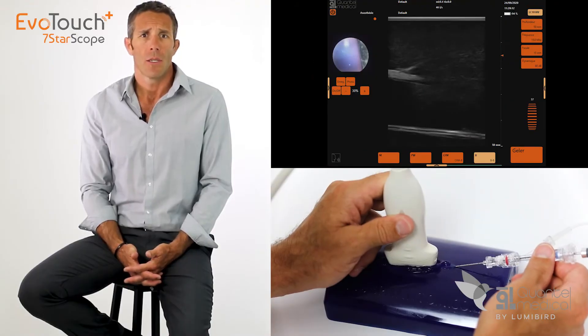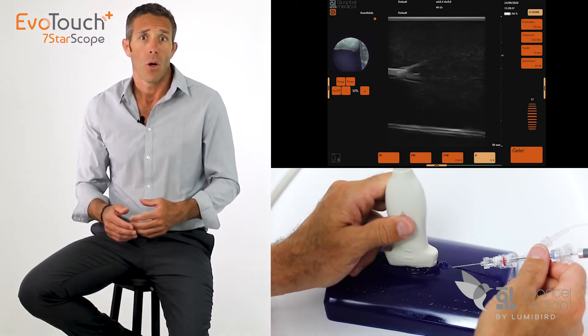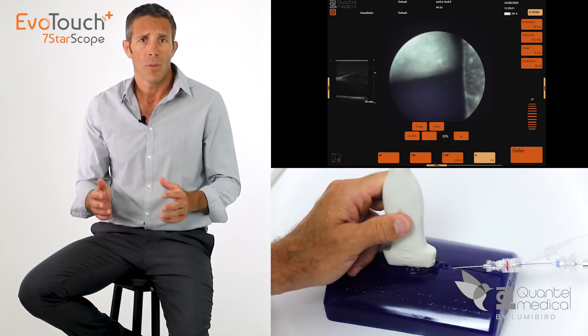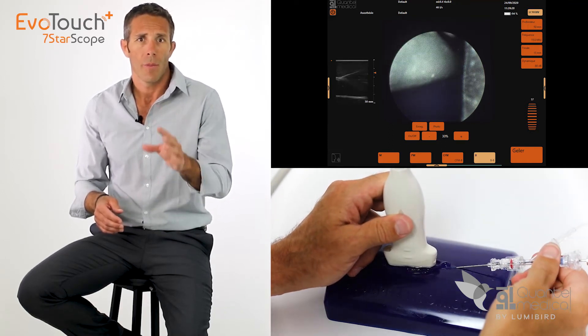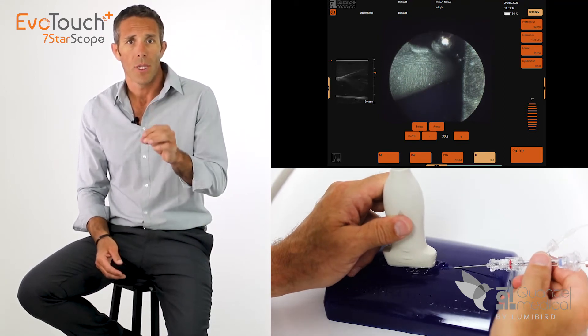Once the needle reaches an area where there is no ultrasound imaging possible — such as behind bones — or if you need a perfect and detailed view of the target area, it is possible to switch to endoscopic imaging. Just one click on the screen to switch from the ultrasound image to the endoscopic one. Your eyes are now truly placed at the tip of the needle.